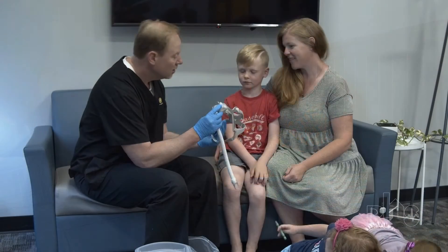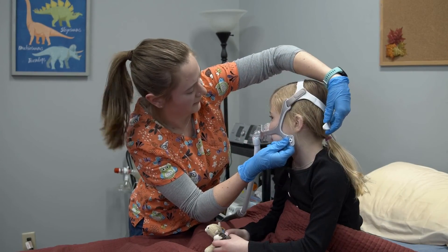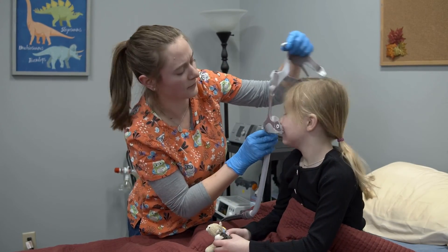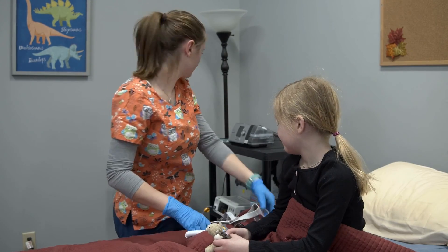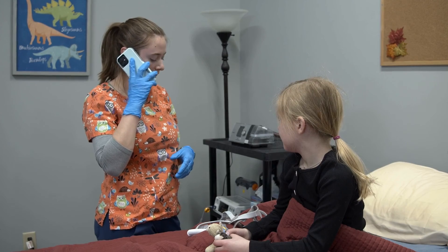The doctor or a respiratory clinician fits the patient for a mask. If the patient's CPAP or BiPAP mask no longer meets their needs, call their physician or durable medical equipment provider for available options.